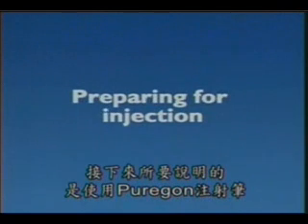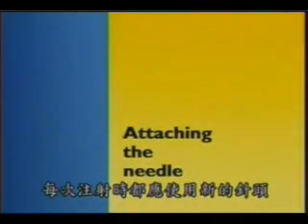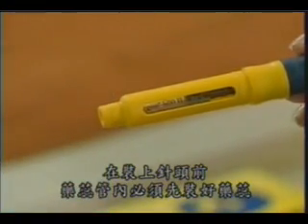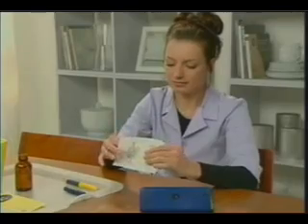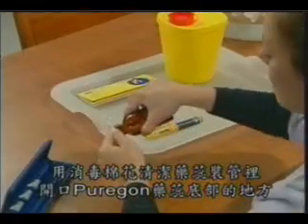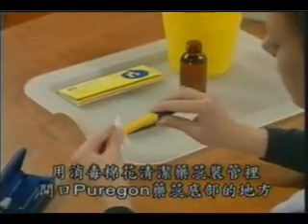The following steps should be performed every time you use Puregon with the Puregon pen. To reduce the risk of infection, use a new sterile needle for each injection. The cartridge holder must have a cartridge in it before you attach a needle. You can see the cartridge through the windows of the yellow cartridge holder. Clean the end of the Puregon cartridge at the open end of the cartridge holder with a disinfectant swab.